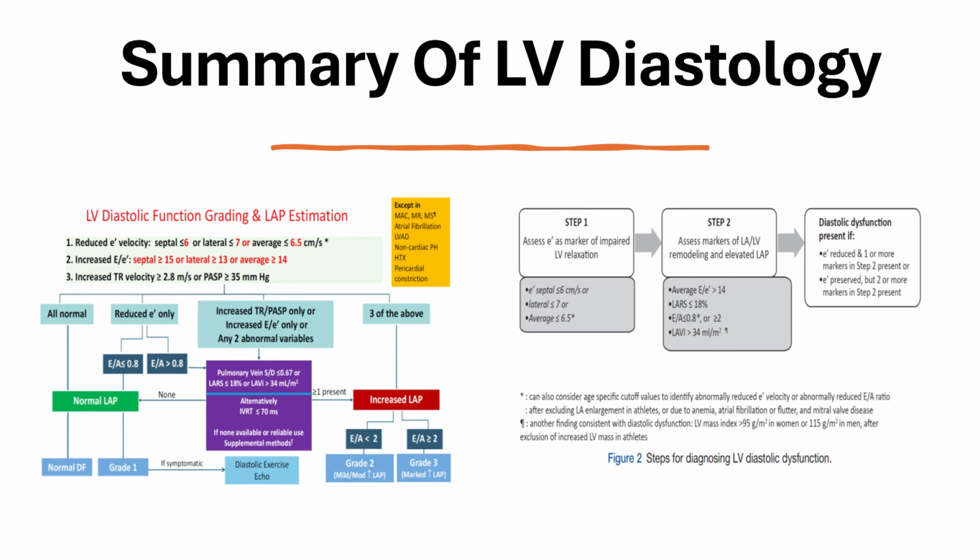It should not be used in patients who have significant mitral valve disease, such as mitral annular calcification or MAC, mitral regurgitation, mitral stenosis, atrial fibrillation, left ventricular assist device, non-cardiac pulmonary hypertension, pericardial constriction, and heart transplant or HTX here.